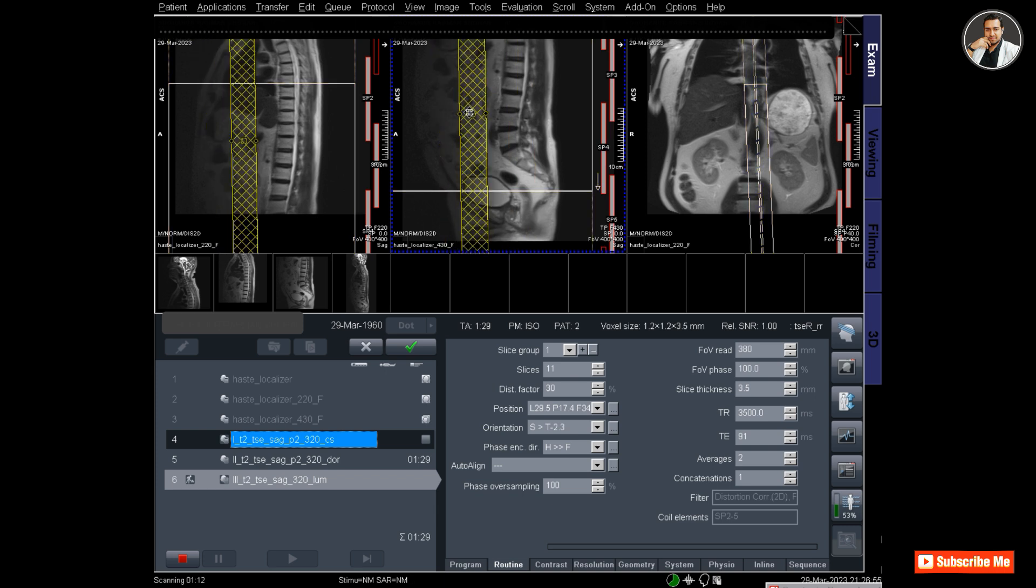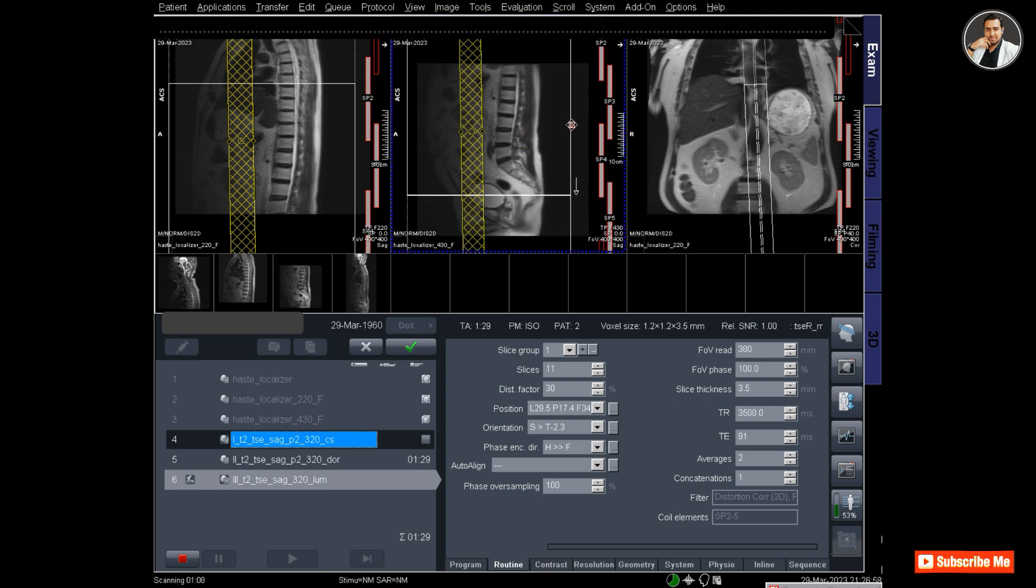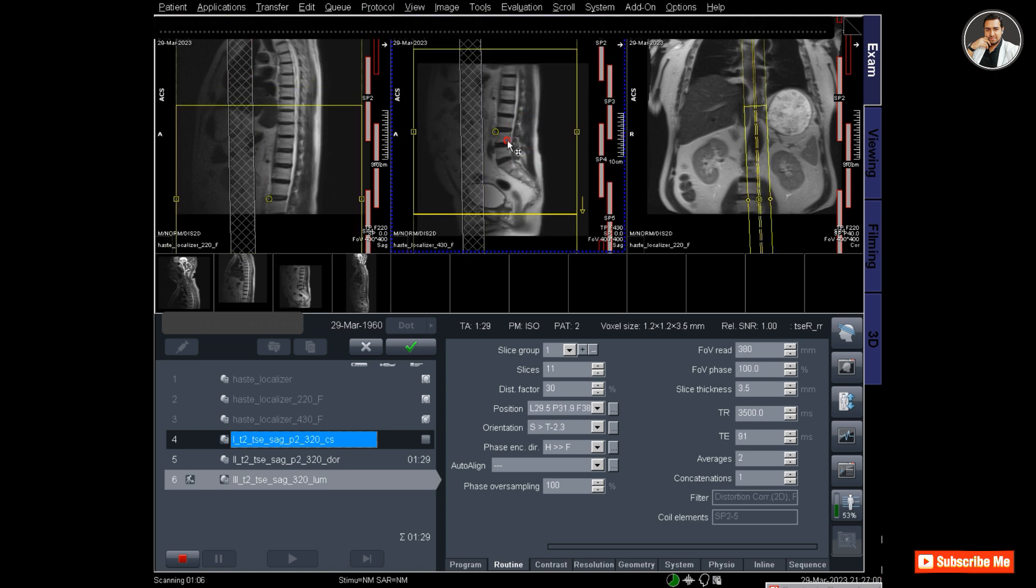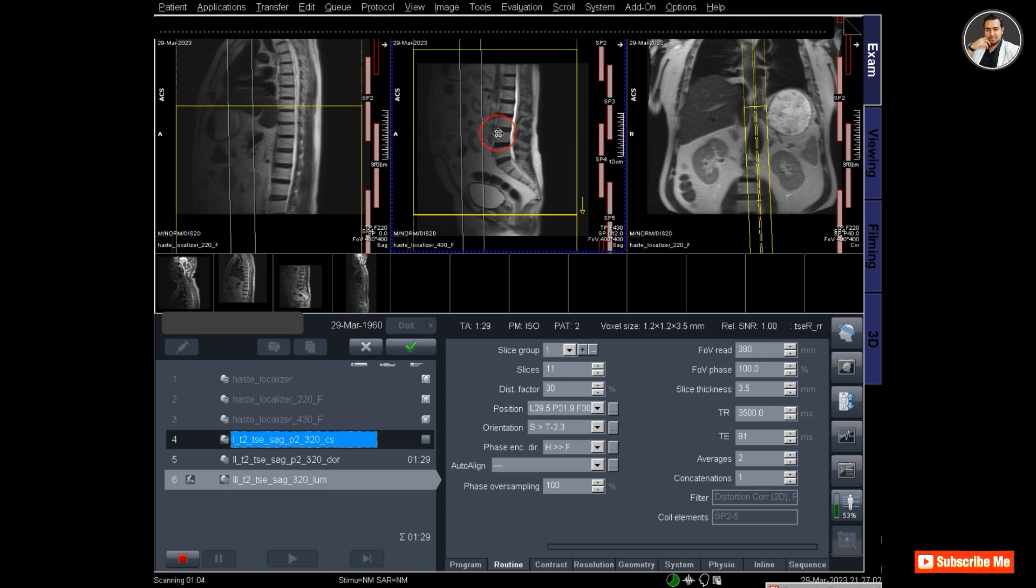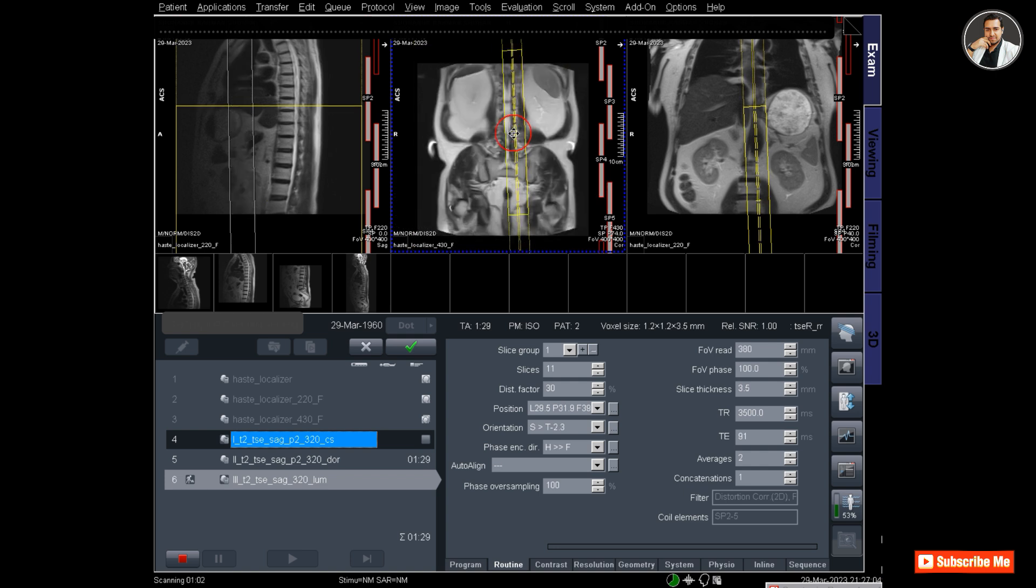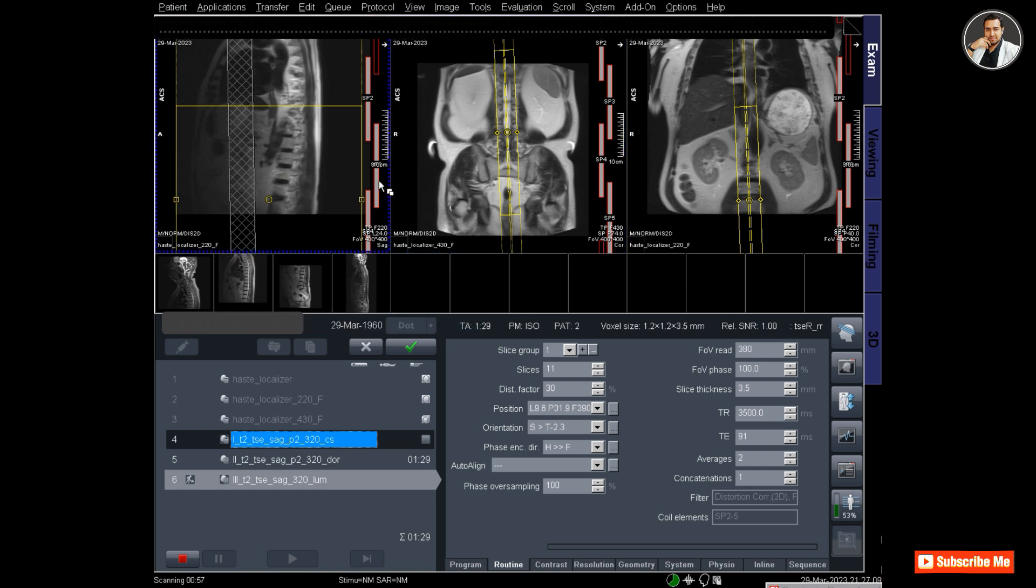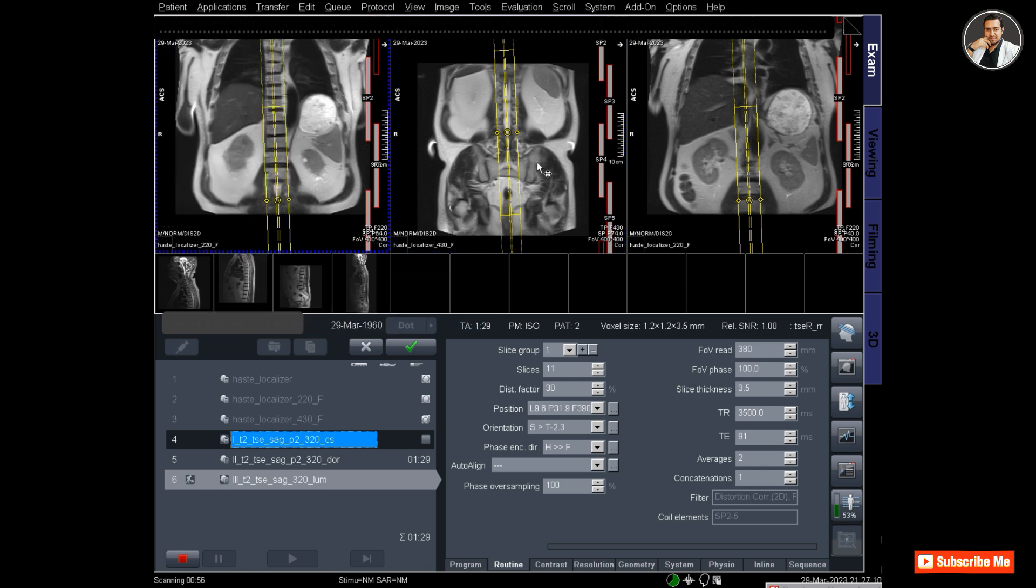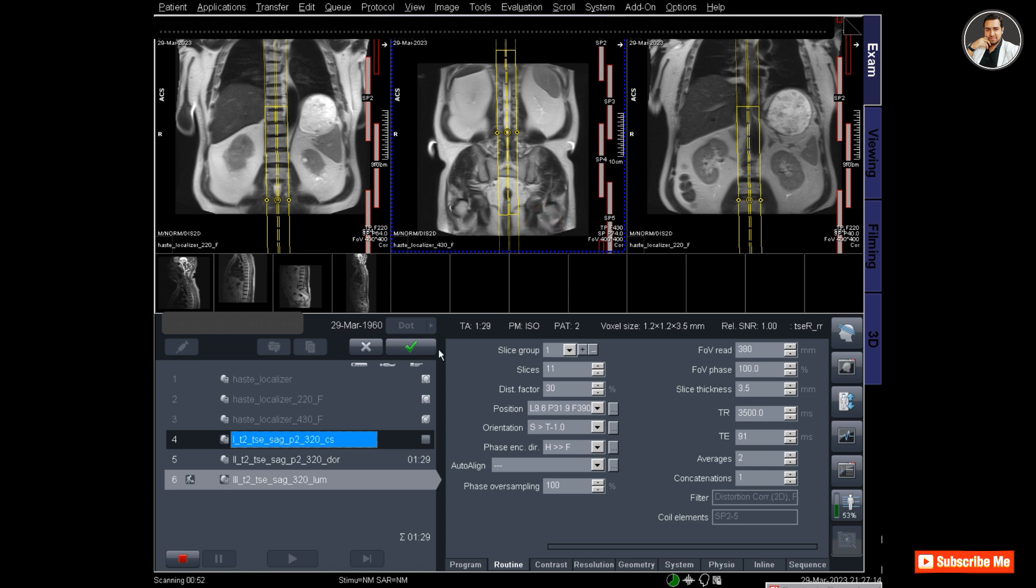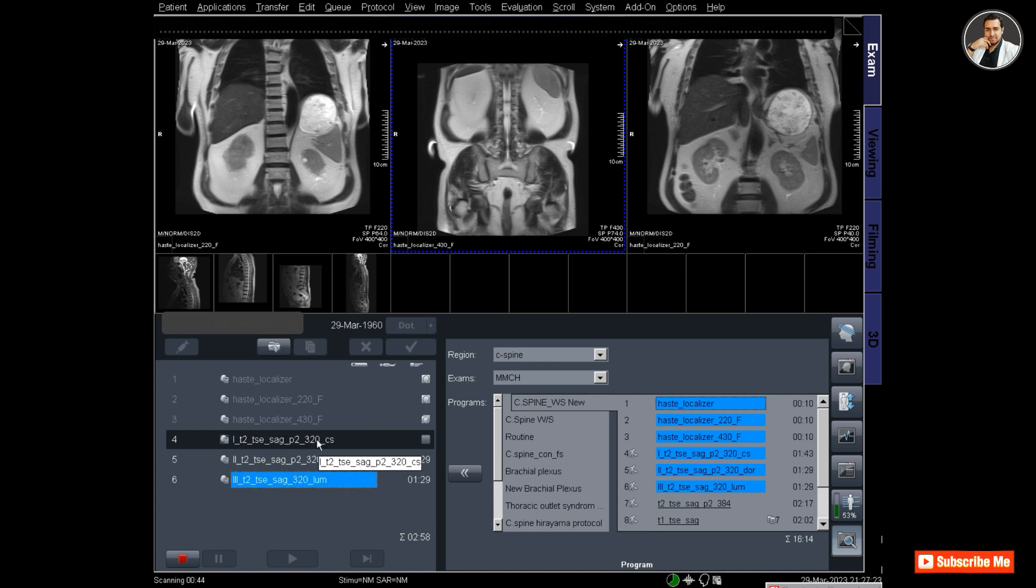Adjust the saturation band in front of the lumbar spine and drag the field of view so that the whole sacrum and coccyx are covered. Now plan the slices on the coronal image and place the mid slice at the spinal cord. Click apply. My three protocols - sagittal cervical, dorsal, and lumbar - have been planned.